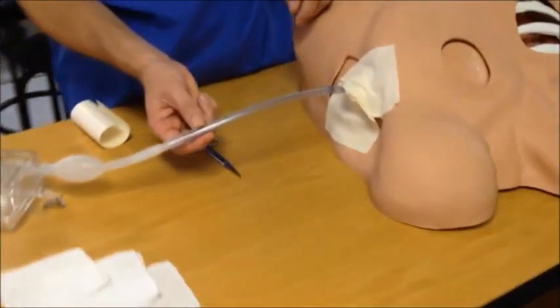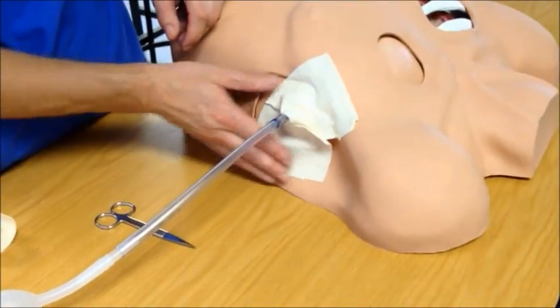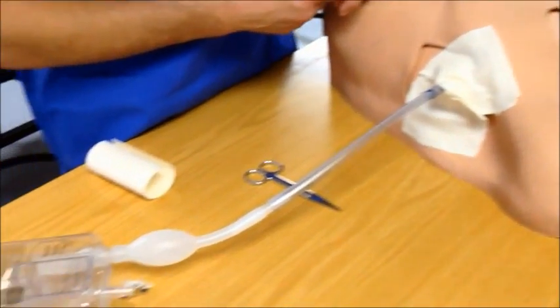Here we have our chest drain, sutured to the chest and lightly dressed, connected to our draining system as shown in the previous video.